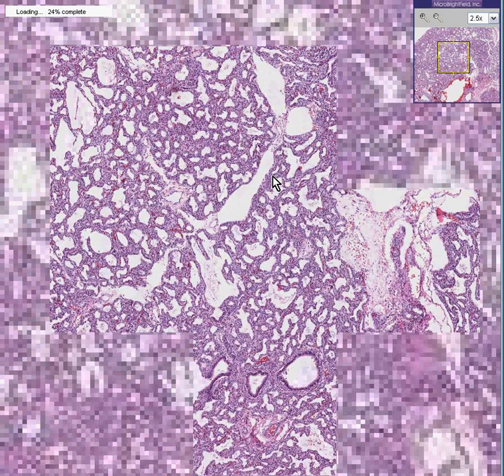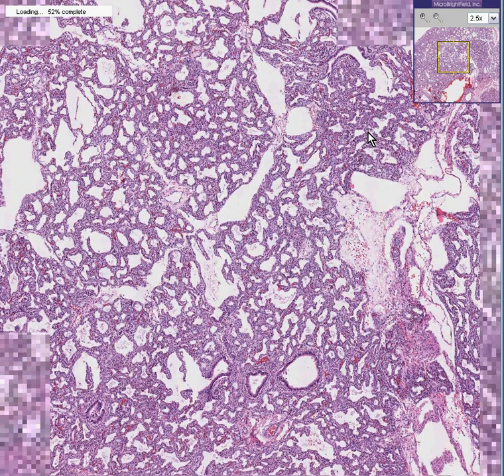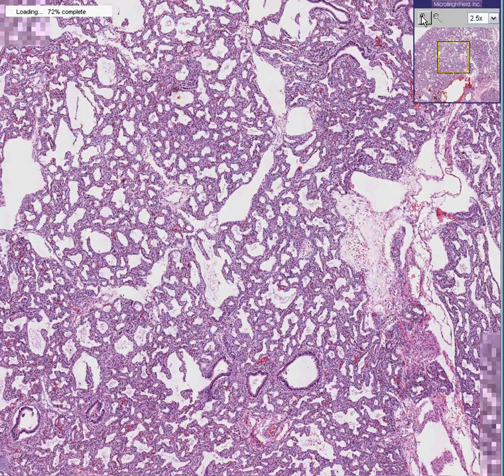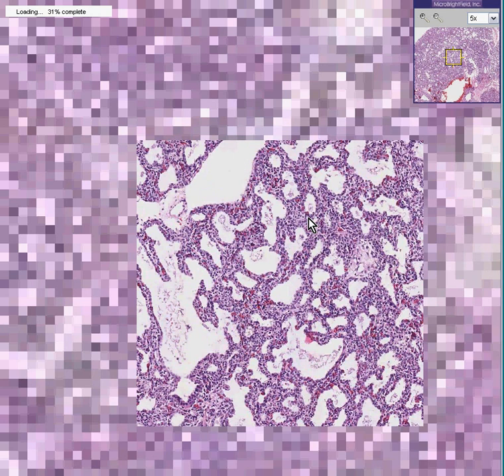If I told you that this was a lung, you'd probably still have a hard time believing me. The first reason is the image hasn't come into focus yet. The second thing is that in the lung, you would always expect the alveoli and alveolar septae to look a lot thinner than this.